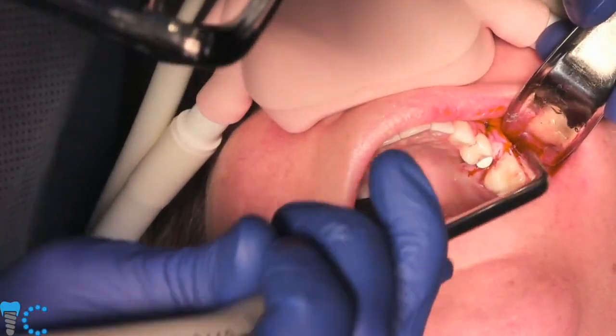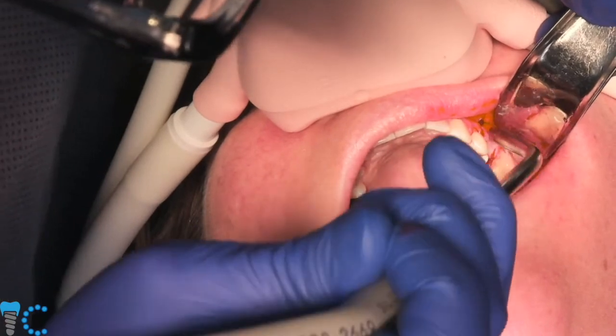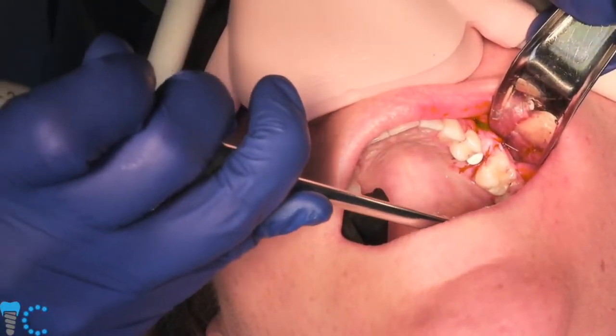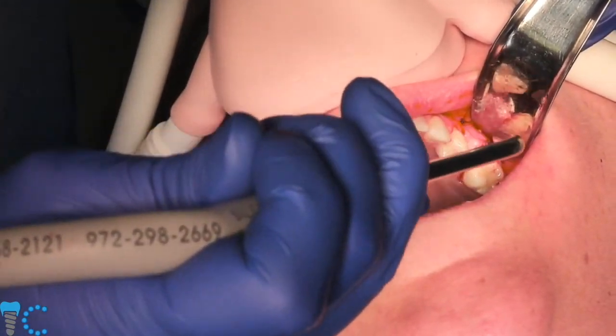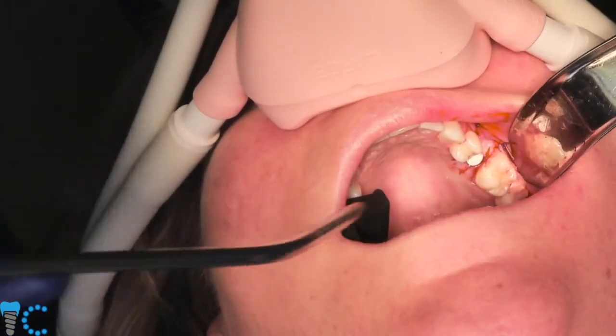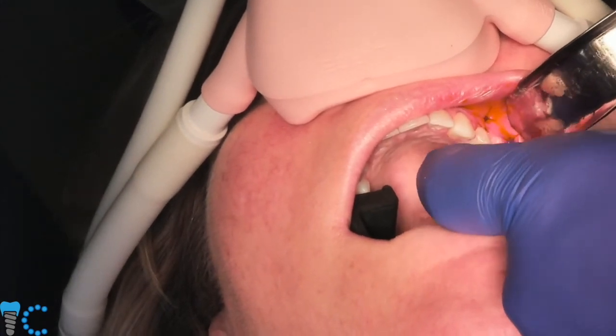Now, do you need any special instruments for cleaning around the implant like you do with titanium? Not really. You don't have an instrument that is sharp enough or strong enough to damage these surfaces. Not a hand instrument. Do they have a bone level implant Z system? Not yet, they don't. Maybe in the future.